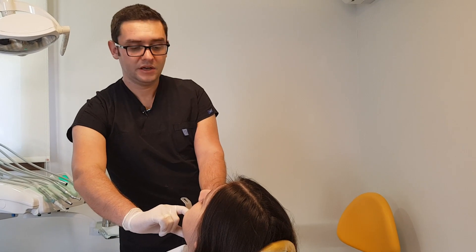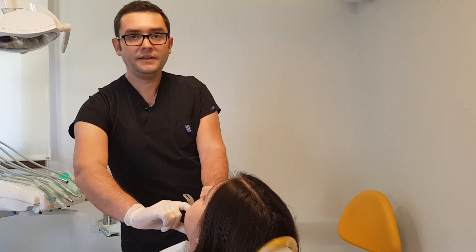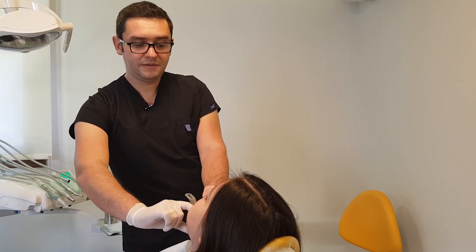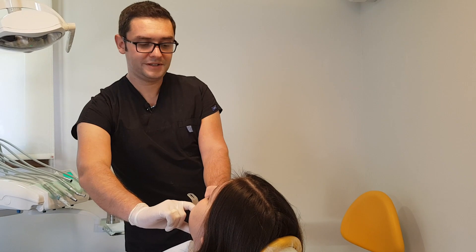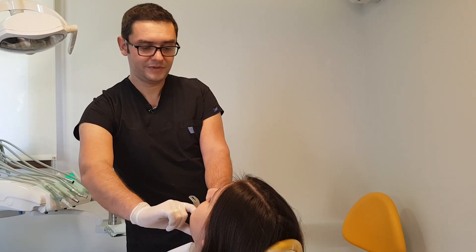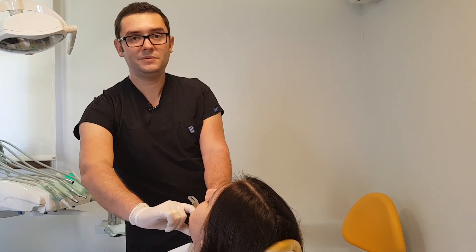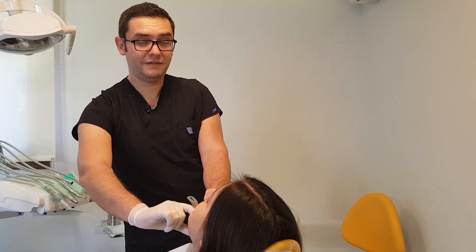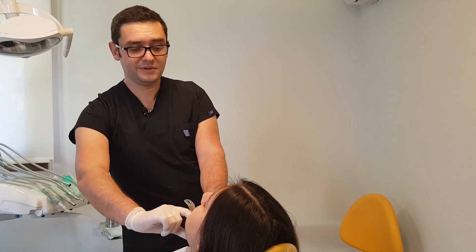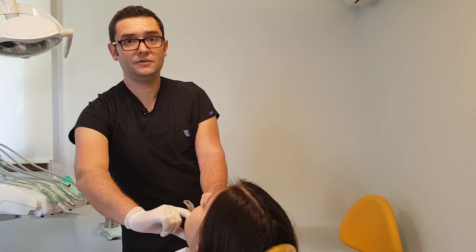Also I shouldn't press too much or too little — it may also cause different impressions. So I am waiting; I have to be very gentle. Today we are lucky. Our patient is very good. She is not gagging or causing a problem. But for some people, taking a dental impression is almost impossible.